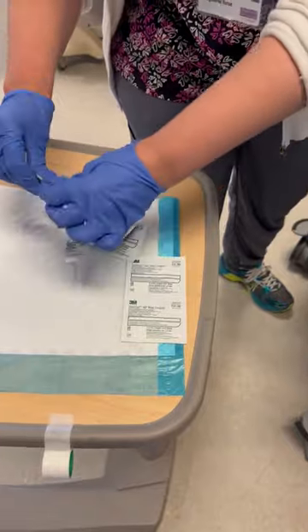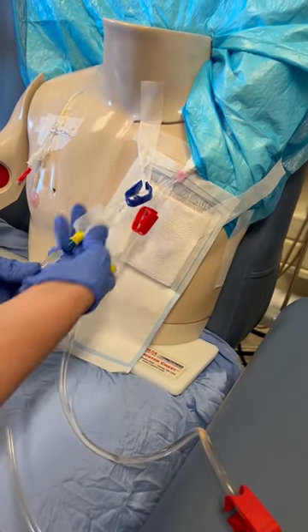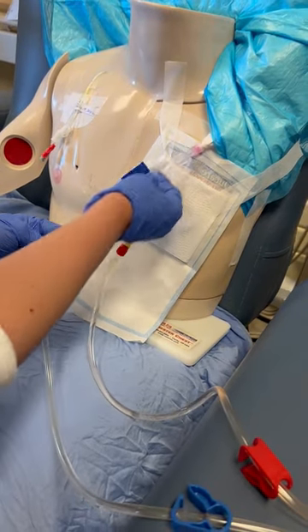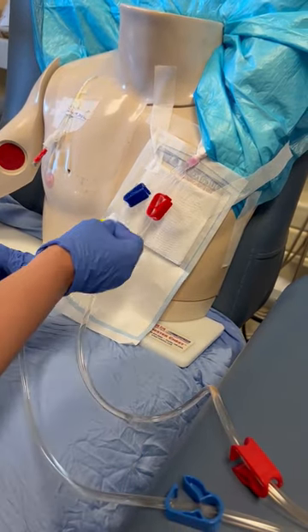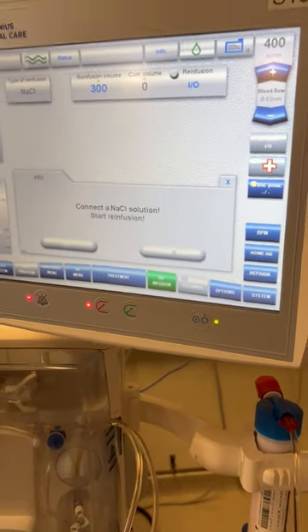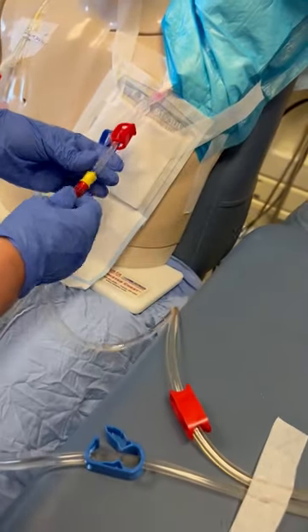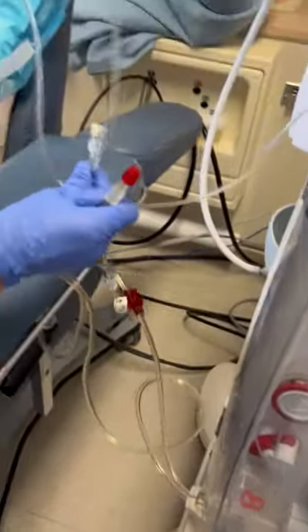We'll repeat with the venous lumen. Once you're ready to disconnect, go ahead and hit start under the re-infusion heading. The machine is now telling us to connect to a saline solution, so we're going to clamp the two clamps on the arterial bloodline and the lumen, then disconnect the bloodline from the tego cap and connect the arterial bloodline to the Y port on the saline line.